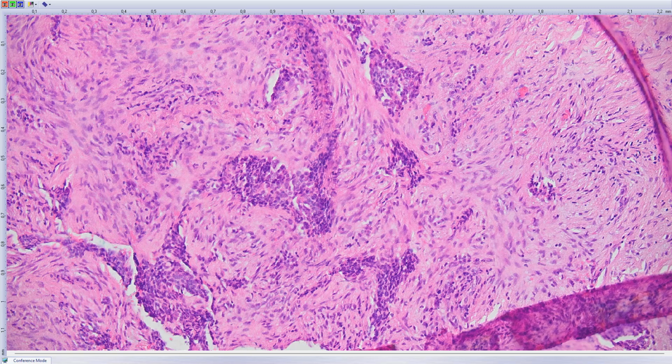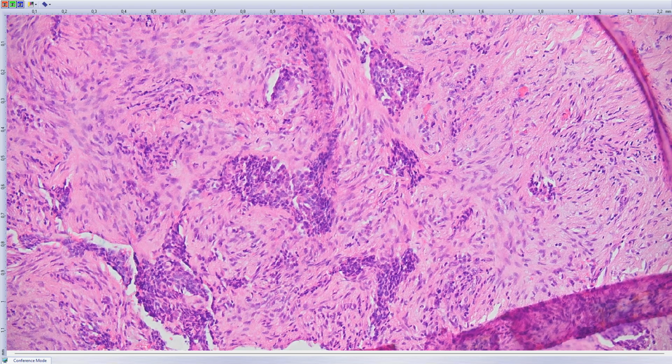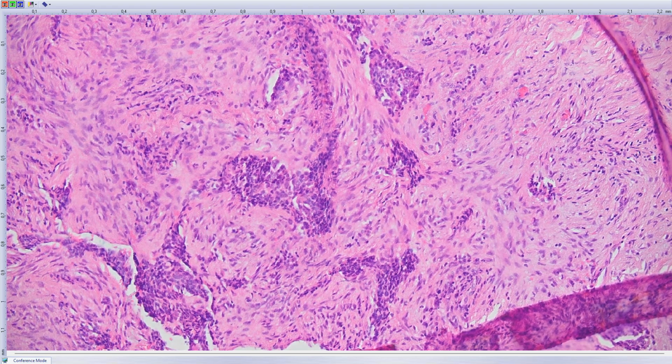So from these negative stainings, you can calculate that we considered the possibility of metastasis from a lung primary cancer, but then it was sent for molecular testing, and it arrived today with the result: fusion YAP1. How do you pronounce it? YAP1 MAML2. YAP1 MAML2. So YAP. Yep, MAML2.